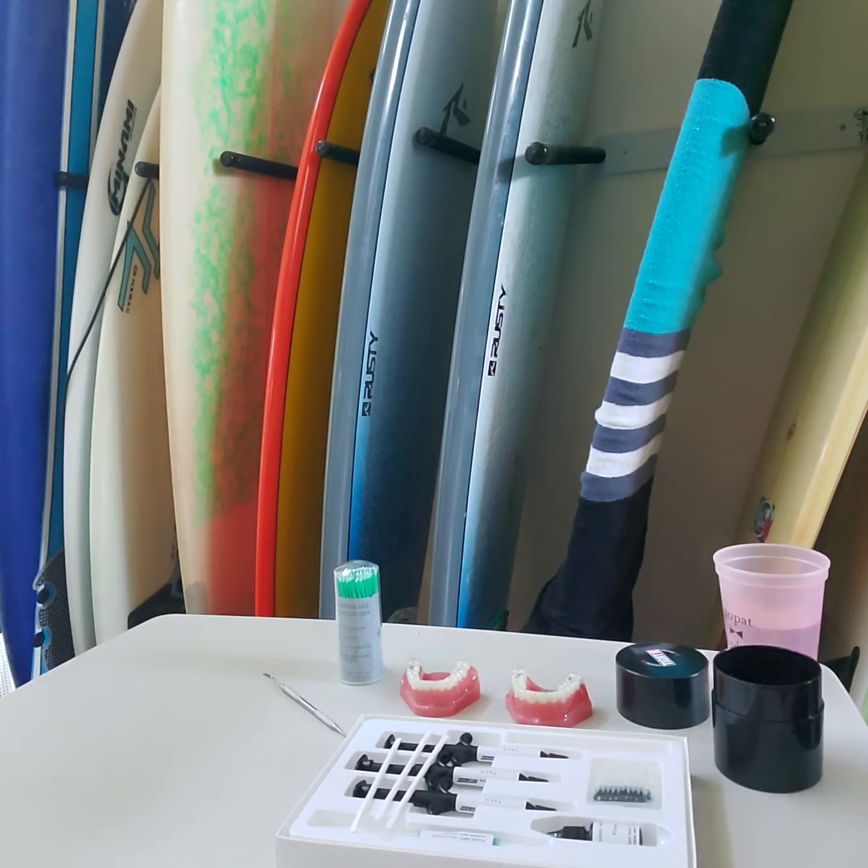But in a nutshell, this is what you're going to do. Of course, you're going to pull up your treatment plan and see what's going on. Do you have IPR? Do you have elastics? Do you have precision cuts? Do you have bite tabs? Do you have buttons? Or is it a plain vanilla kind of treatment plan with just movement and attachments? So most likely you're going to have attachments, which is really what we're going to be talking about today.